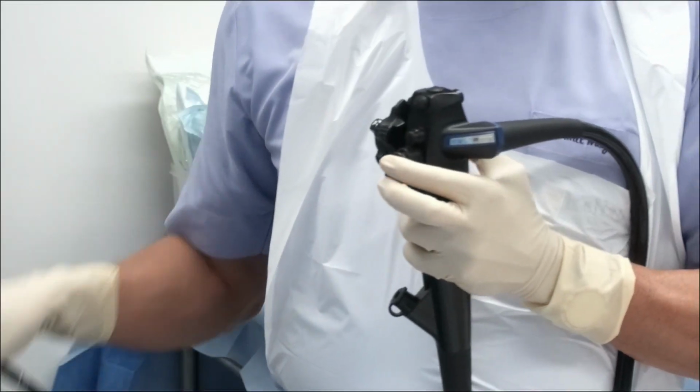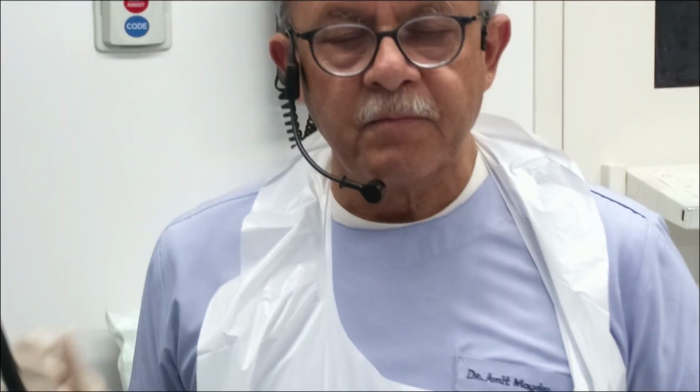So this is how a upper GI endoscopic procedure is performed in totality, by which we can visualize each and every square centimeter of the stomach as well as the proximal duodenum.